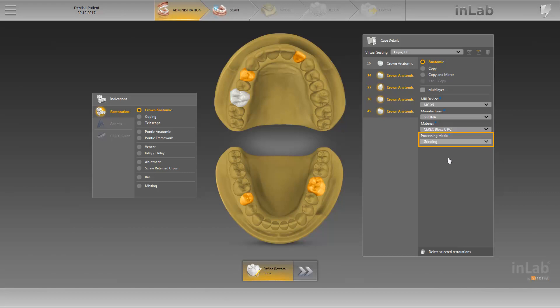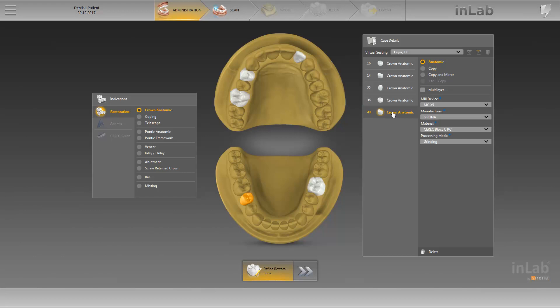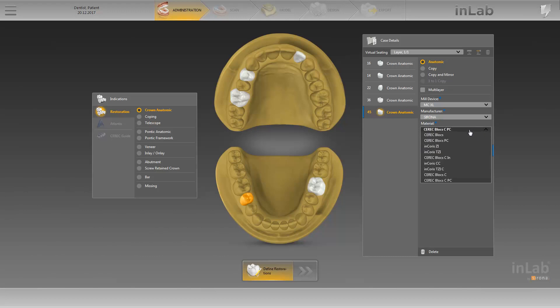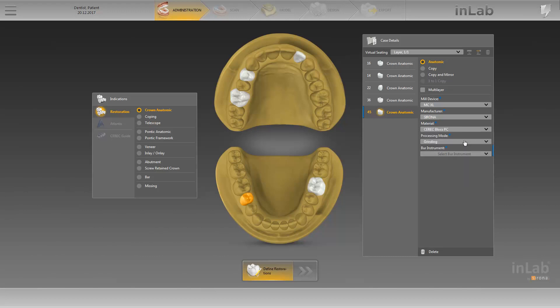The processing mode previously marked in blue is automatically defined, as certain materials can only be grinded and not milled. If you wish to modify the fields for individual restorations, simply click on the restoration in question and the restorations previously marked in orange in the group are no longer selected. You can now modify the various fields of the restoration on 4-5. After selecting the CEREC Blocks PC material, a further mandatory field appears, as various grinder combinations are possible for this material. These can be specified under the Burr Instrument field.